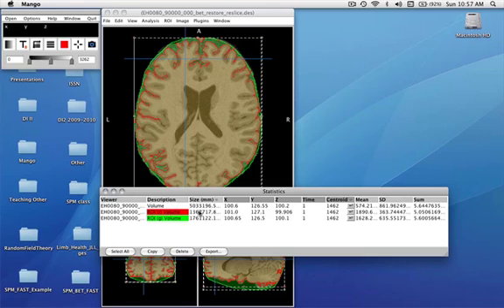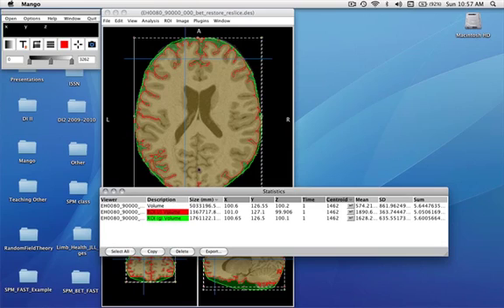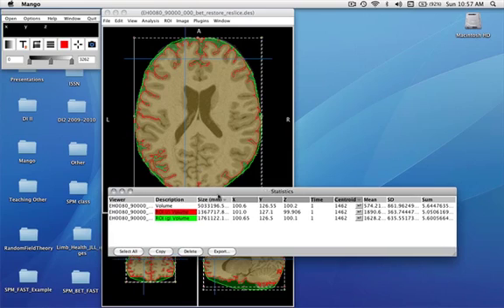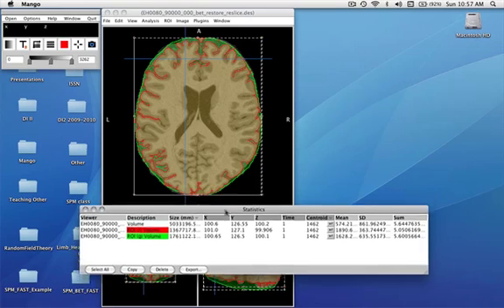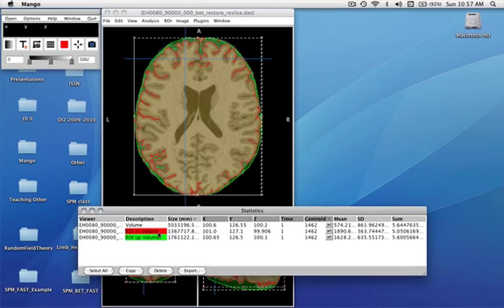There's some gyrification studies that relate the convex hull size and surface area to the brain size and surface areas. But this is a start looking at it by volume. Now the volume is measured, in this case, in cubic millimeters. The basic unit of measure in Mango is generally millimeters.